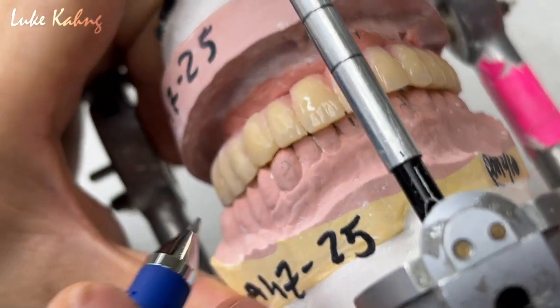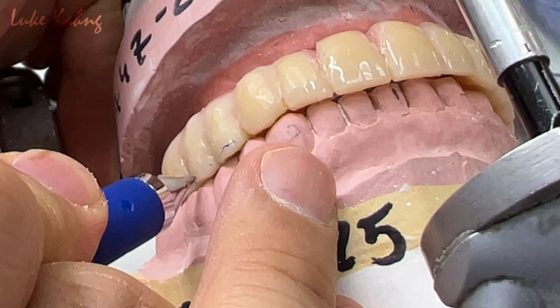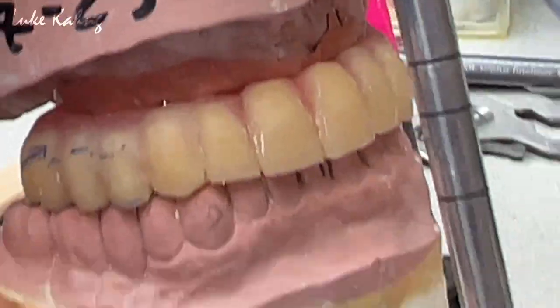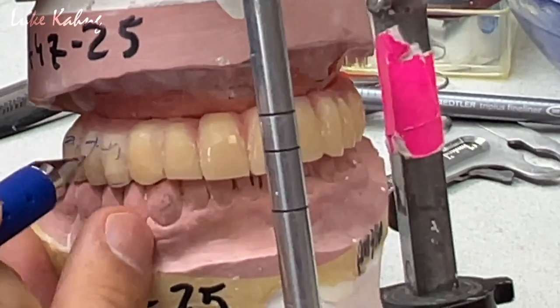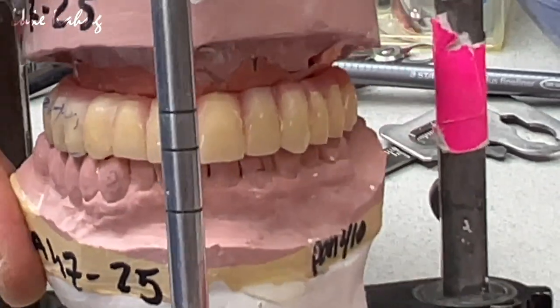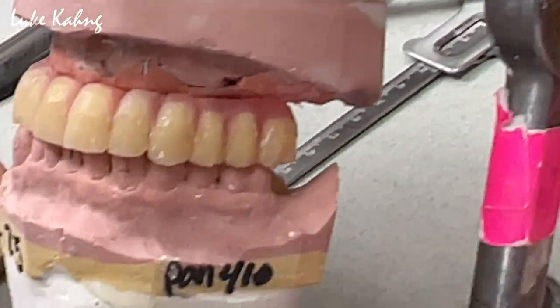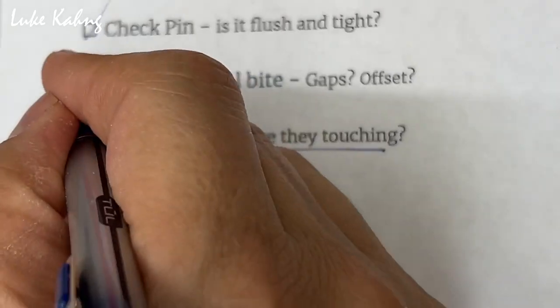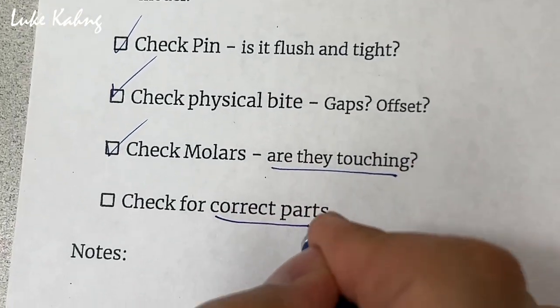I can bring it in here — this is a cheek bite. There is a cheek bite, so I can bring it down. Now check molar — any touching. That one is important too. Check for gap. Check for correct parts.